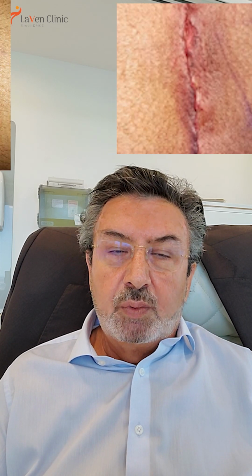We perform it purely by laser, sometimes with the scope and sometimes without. And the scope is not that important. A lot of people ask about VAFT. VAFT is something secondary. What's more important is what we do with the VAFT. So for those cases, we do the repair with a little plastic surgery in the site, no stitches on the outside, with nearly 100% cure, which is something that we never had in the past.